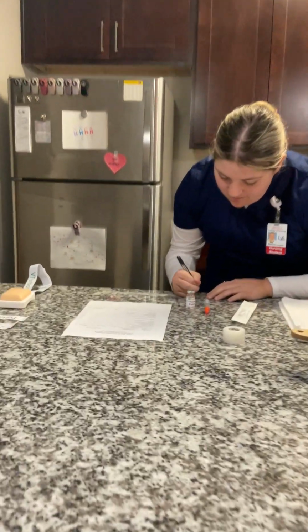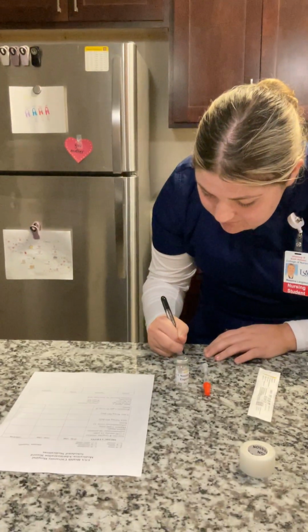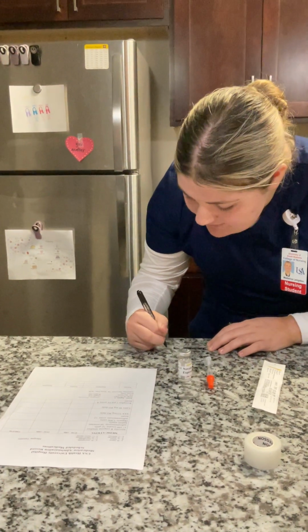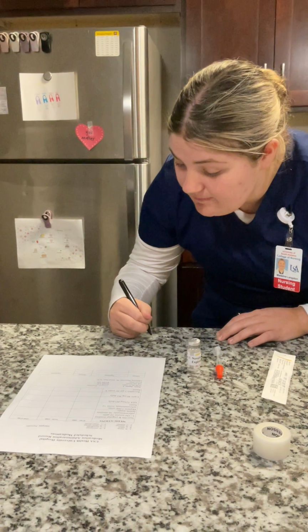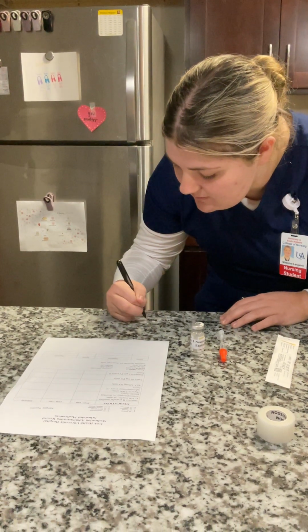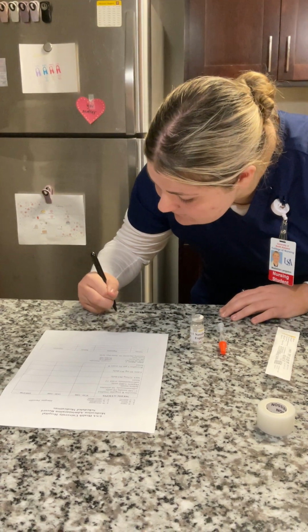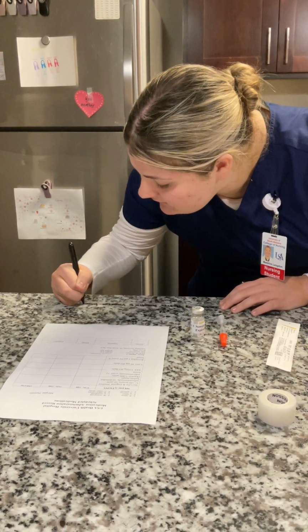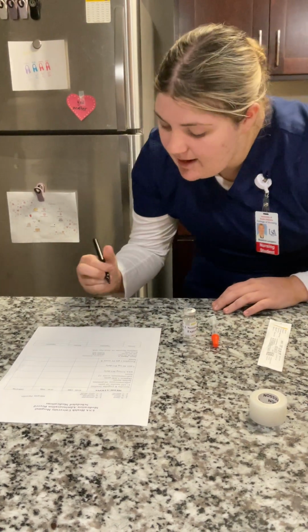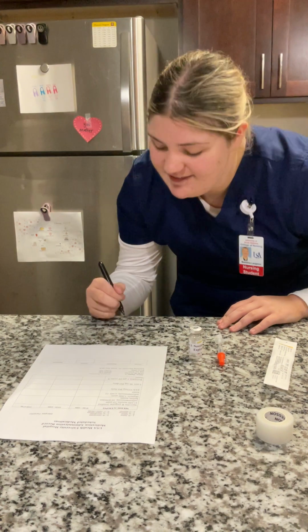So today is Jaguar J. Jones. And the medication is Novolin R regular insulin. And I'm going to put the units on here also, or the dose, and it's 10 units.